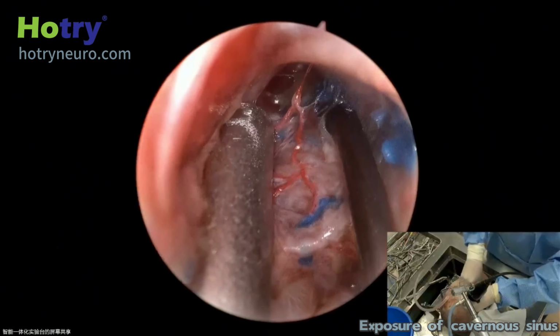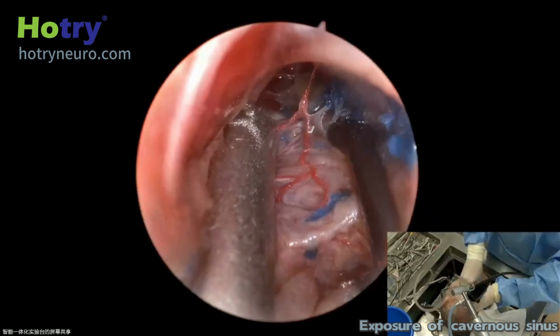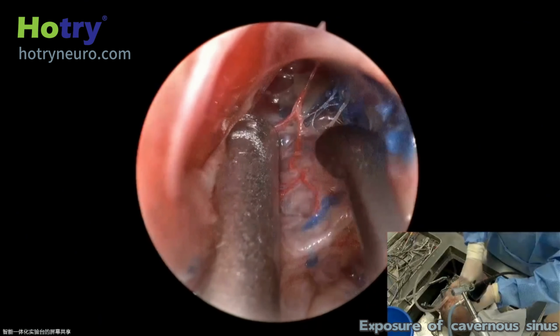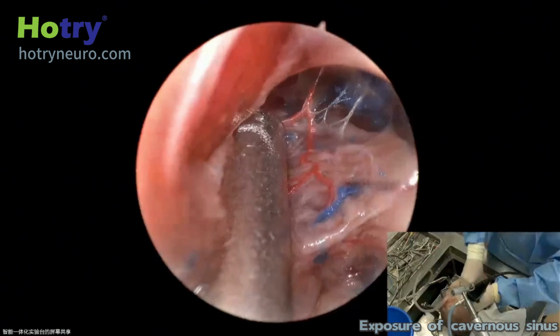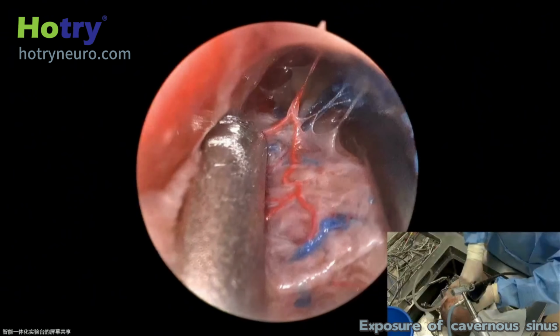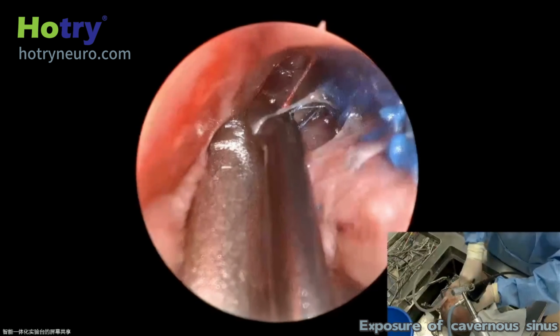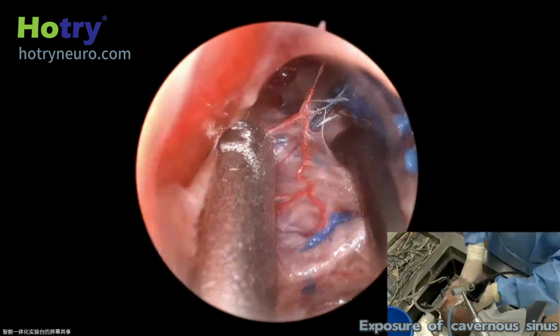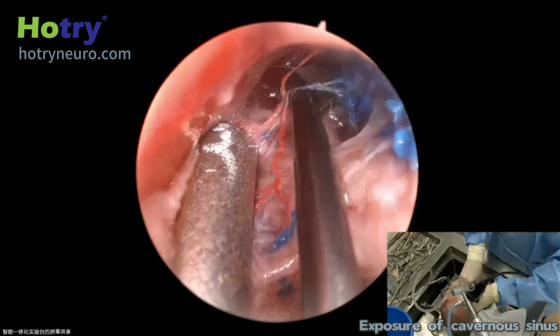So this is the sixth nerve. The abducens nerve runs parallel to V1, but just medial.